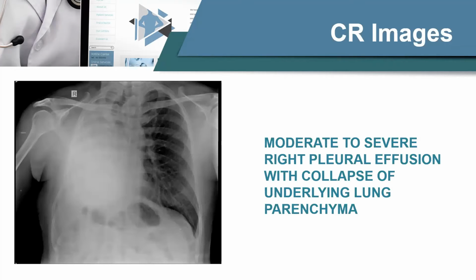This patient had severe pleural effusion with the collapse of underlying parenchyma. He was breathless when he came to the center. My technicians were able to take this good radiograph within 10 minutes, and I took 5 more minutes to report it. So in 15 minutes, the patient went off with the reports and he was satisfied. And even the doctors were satisfied. Next slide, please.